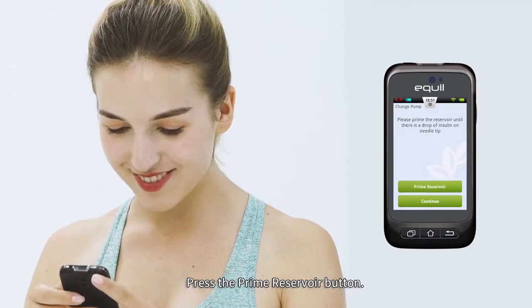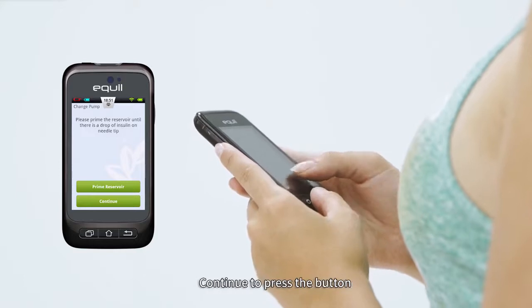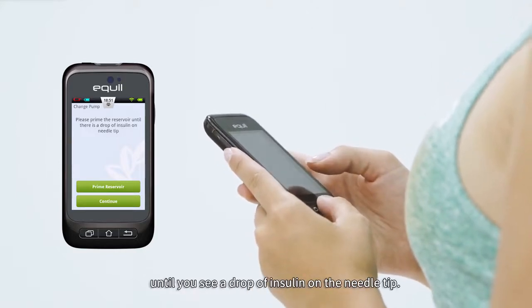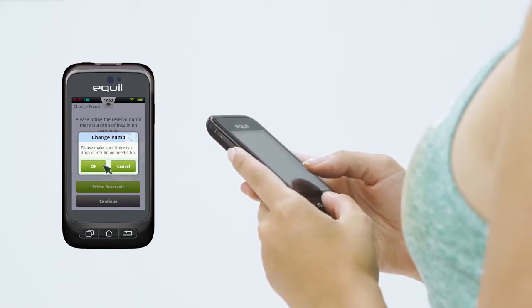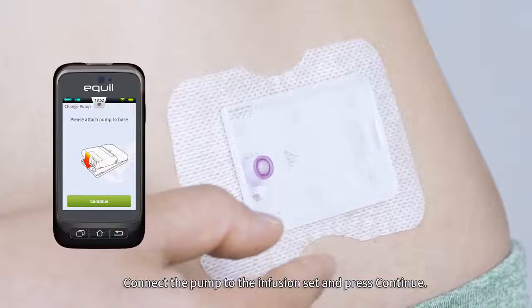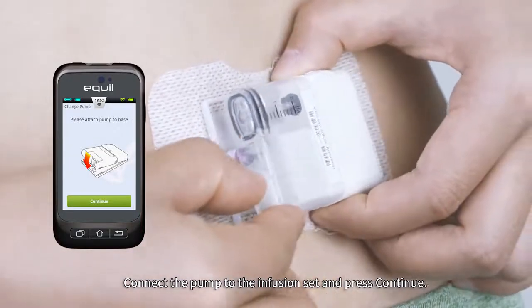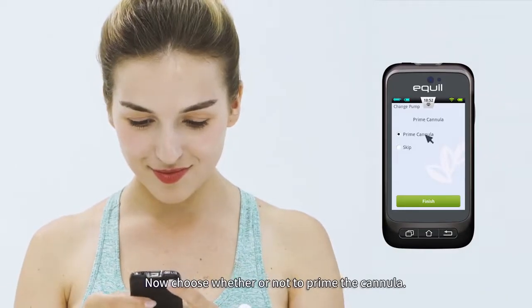Press the prime reservoir button. The plunger will begin to move slowly. Continue to press the button until you see a drop of insulin on the needle tip. Now press Continue. Connect the pump to the infusion set and press Continue. Now choose whether or not to prime the cannula.